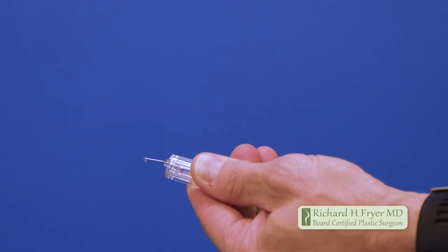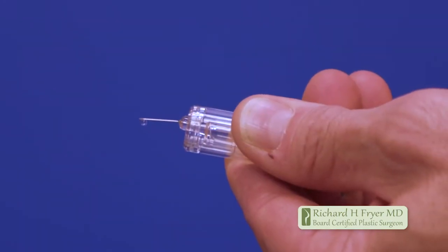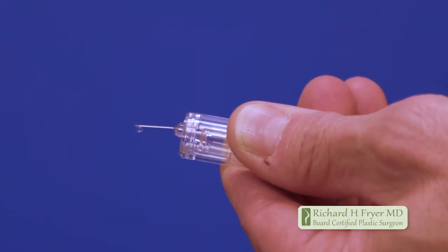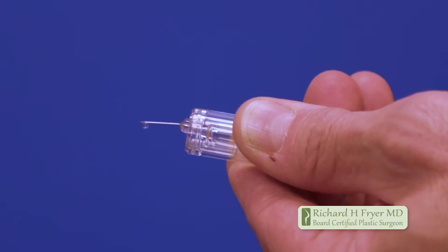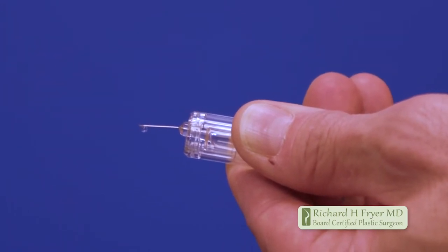There are usually about five or six tiny drops of medication that come out from the surface of the needle, and that's not a problem — it's not wasted, just something you can expect. Now you're ready to give yourself the shot. There are several tricks that can make this a lot more comfortable and less painful.